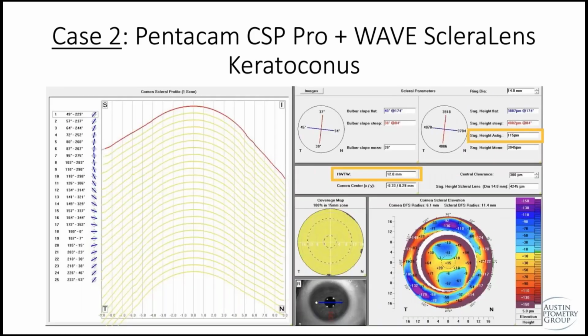And then this is the CSP. So again, the CSP Pro, you can get everything in essentially one shot. That's always my preference. I will try as hard as I can to do that because I just don't generally like the idea of stitching together data and merging or averaging data points. I just want true data in one go.